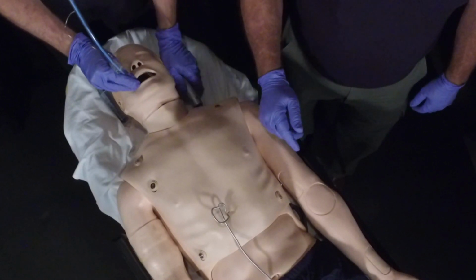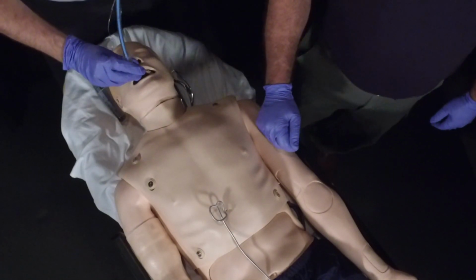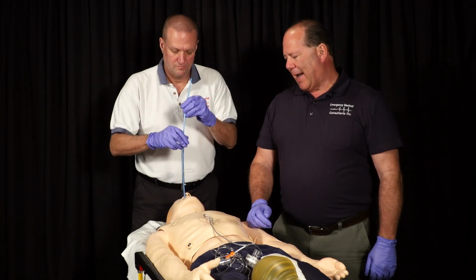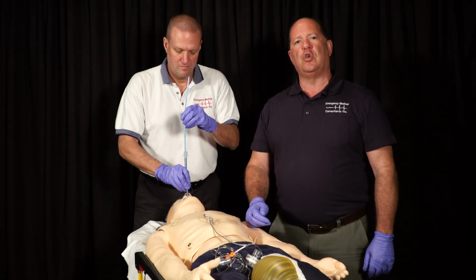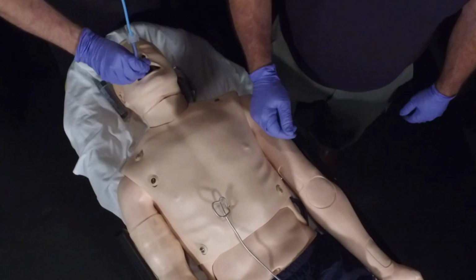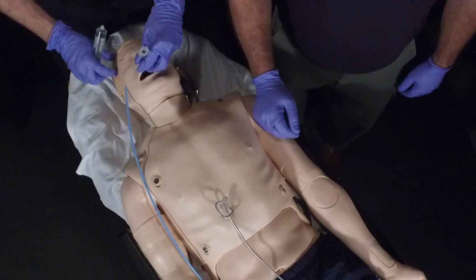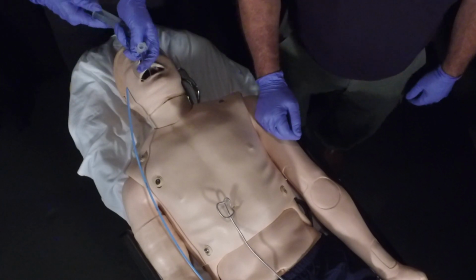So we feel this device actually clicking on the tracheal rings. Once we feel that, slide the tube down the back of the throat. Keep the tube beveled end along the base of the tongue so it slides down there. You've now just guided the tube into the trachea by feeling your way in.